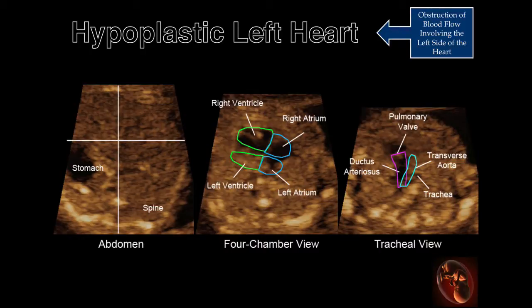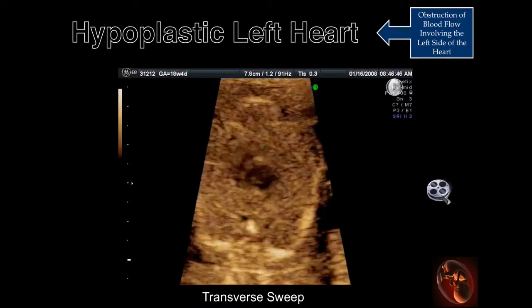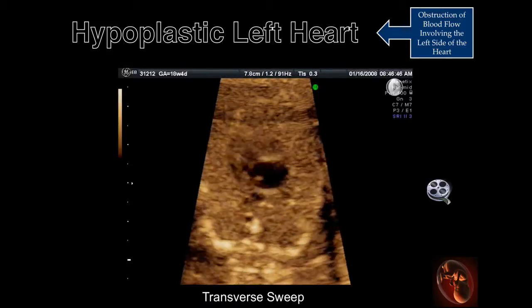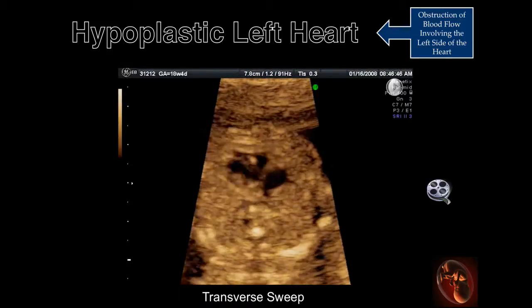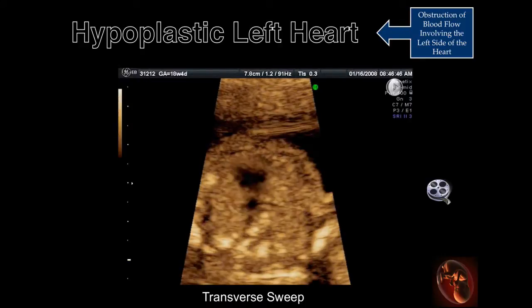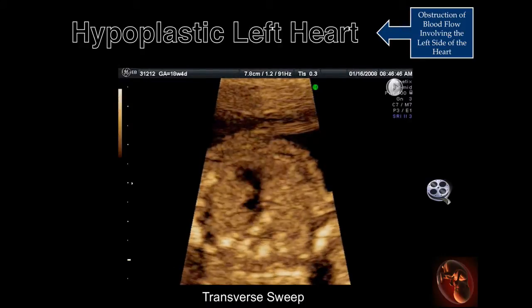This sequence of images demonstrates an overlay of what should be seen in the normal fetus. This cine clip demonstrates a sweep from the abdomen to the upper chest showing the pathology described in the previous slides.